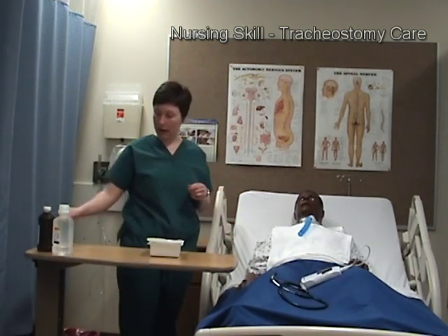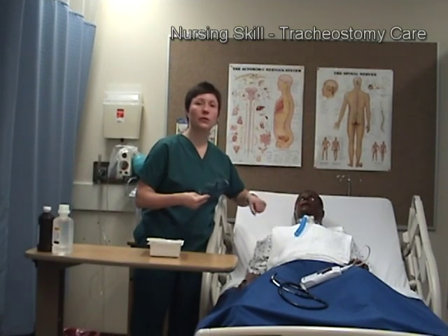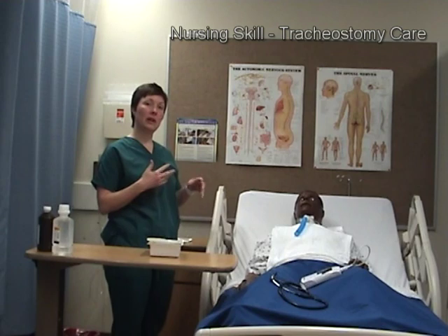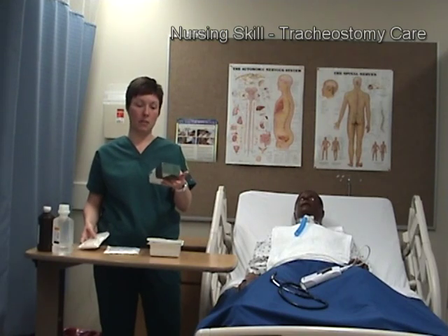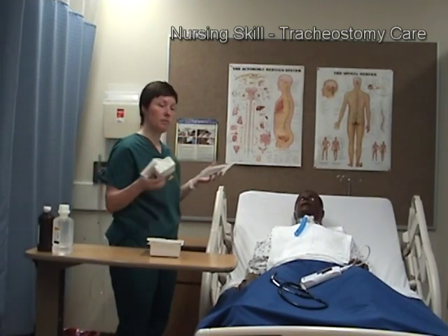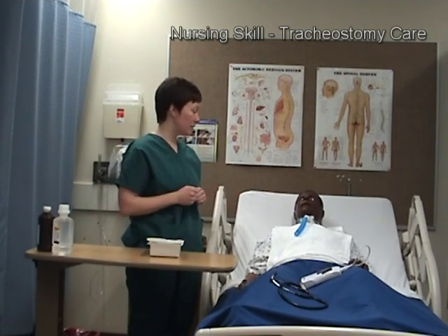I've also brought in goggles as part of my PPE. Sometimes there can be fluid and secretions that may come up during the treatment, so we want to avoid that if at all possible. Because I'm already in the patient's room, I've also brought extras in case I need them: an extra cannula, an extra fenestrated drape, and an extra set of sterile gloves. This will allow me to avoid going in and out of the room, making it a faster process.